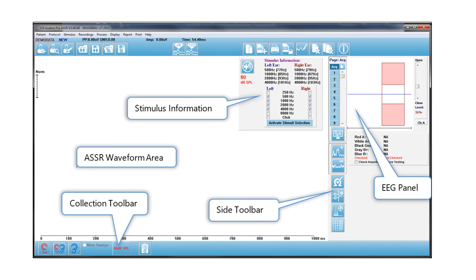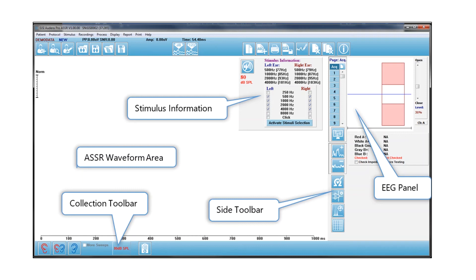The stimulus information is in the upper right corner. This is where you will select the test frequencies that you're going to be presenting to your patient.